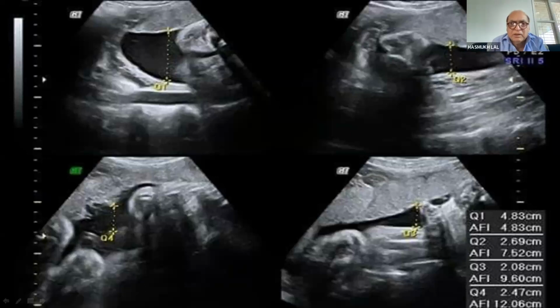Right. So the first question is: obstetric ultrasound is inherently difficult due to. I think all of the above is the right answer, because, as Ajit sir has already told, the fetal anatomy is complex, shadowing is one aspect, and maternal body habitus. We face this problem day by day, and nobody will be sympathetic to us if we miss something.